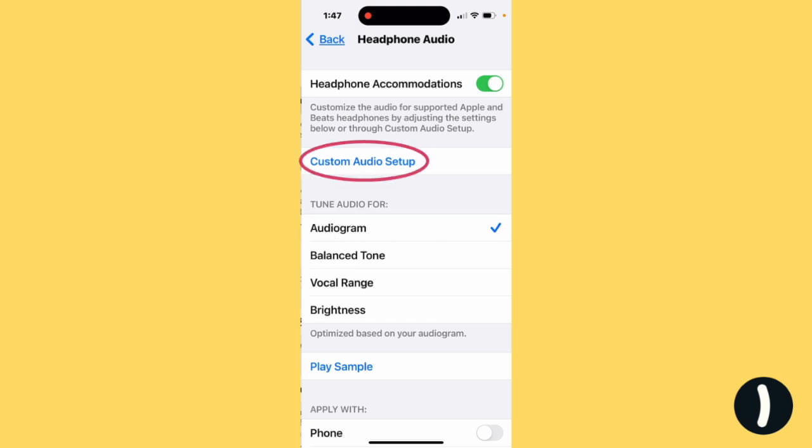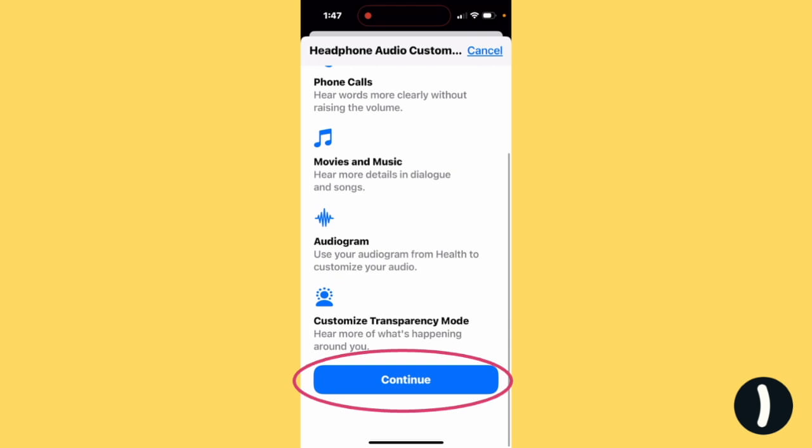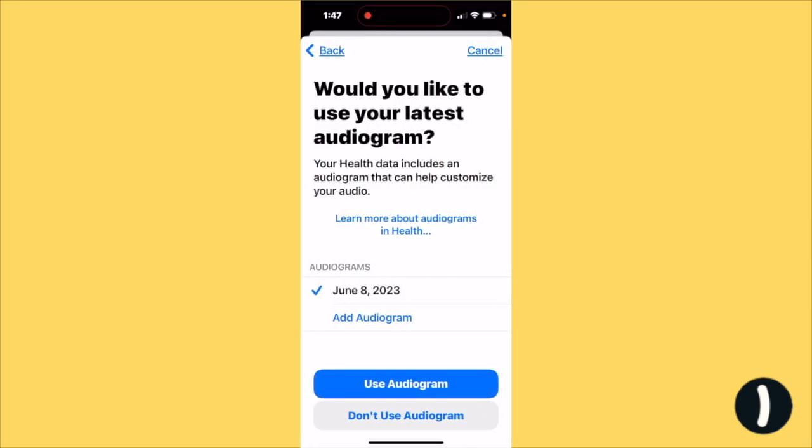Then tap Custom Audio Setup and hit Continue. Here you can see your current audiogram, but if you don't have one, just tap Add Audiogram. Or you can update yours if yours isn't current.